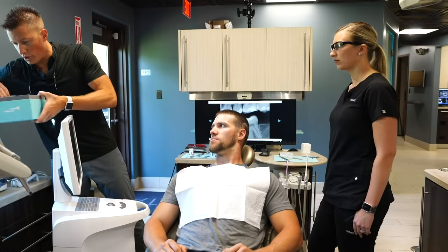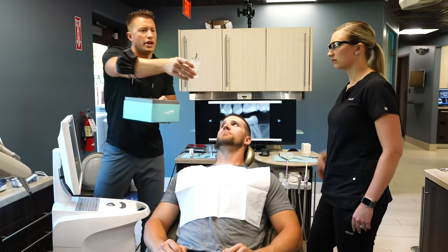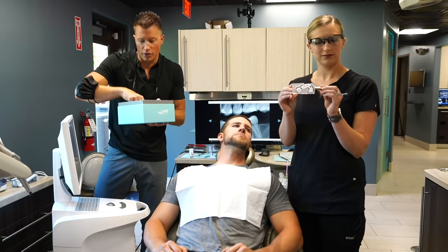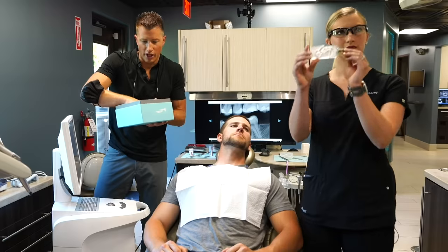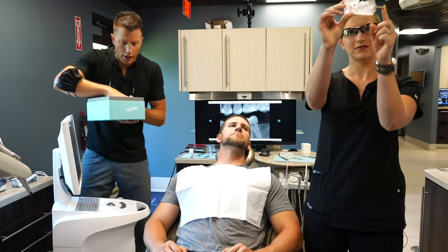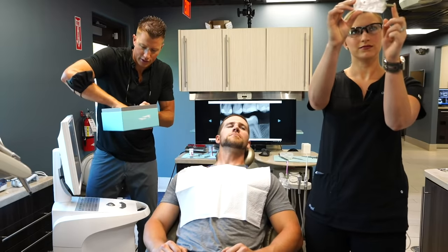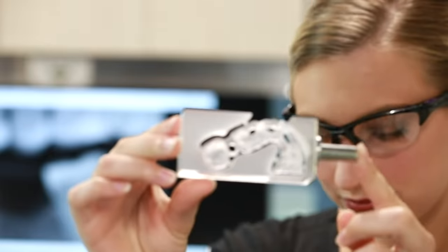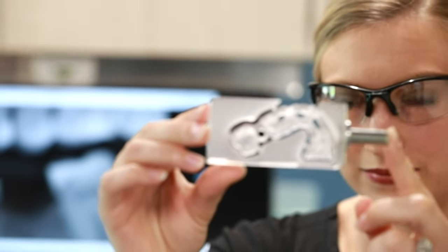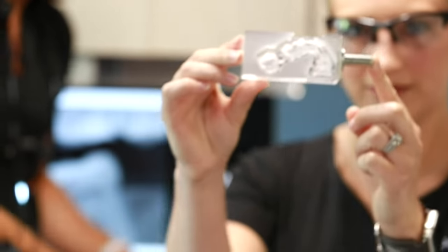Now I forgot to get one of these out while this model is getting created. Sorry, Michael, I know I'm running all over the place for you, but if you want to hold that up, Des, that is what the guide we'll be creating would look like. Give everybody kind of a preview of that. And then we've got a couple of different implants so you can see what that looks like too. And we'll show those throughout the appointment. We'll get to see that one made specifically for Trey in just a few minutes.